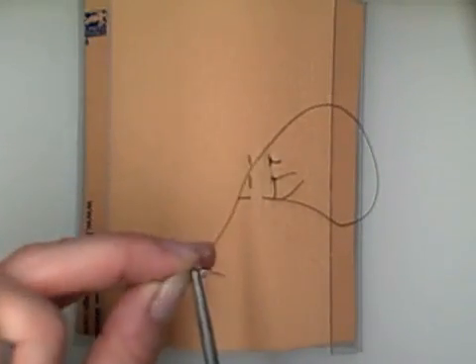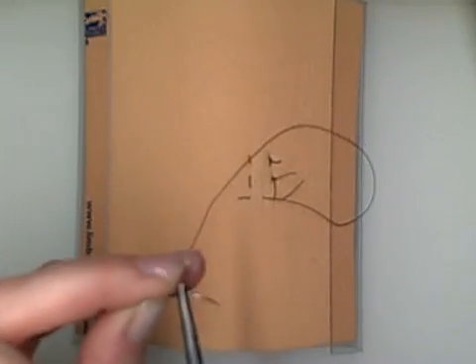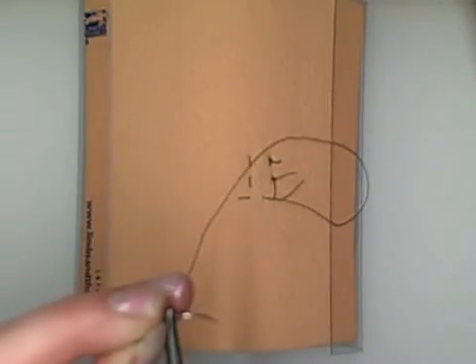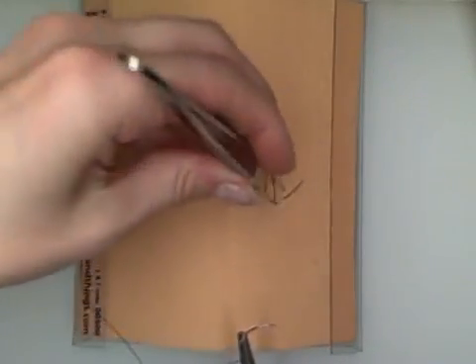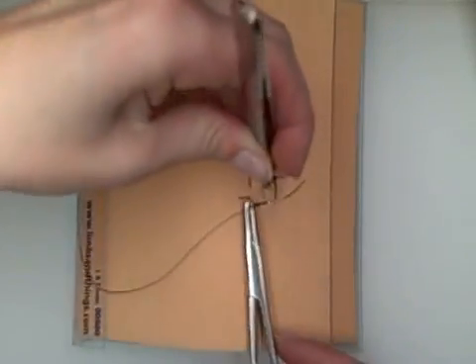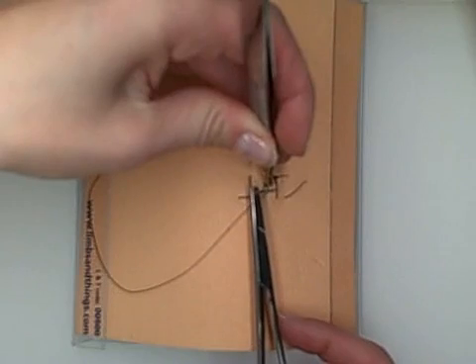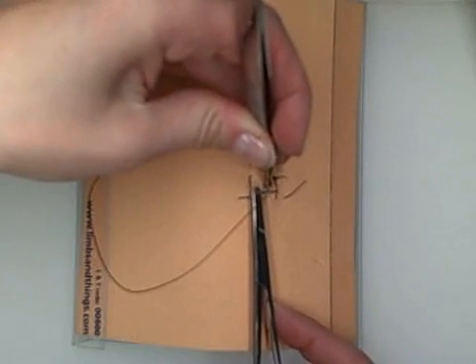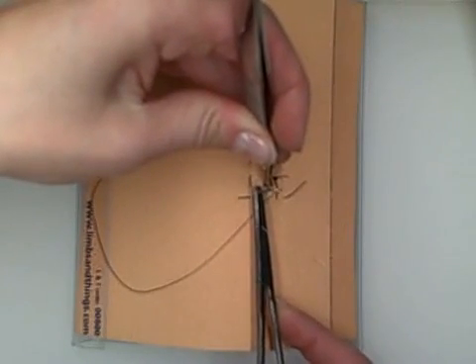And again, we're going to reload the needle backwards. And we're going to take a nice shallow bite.